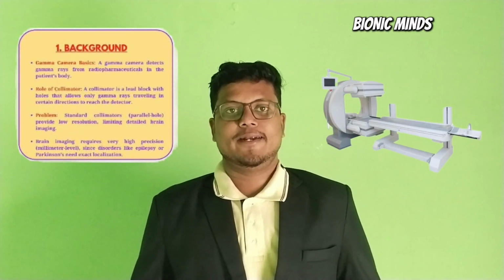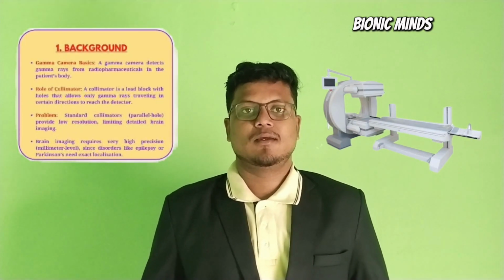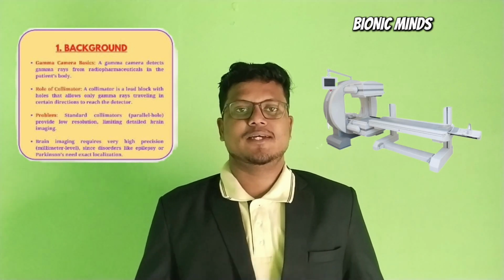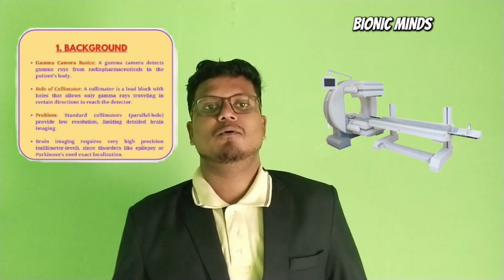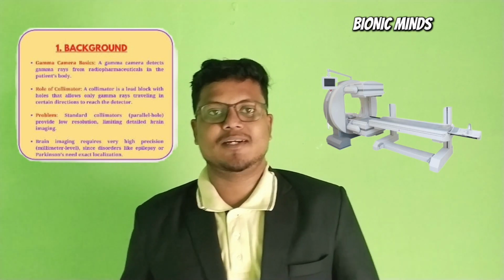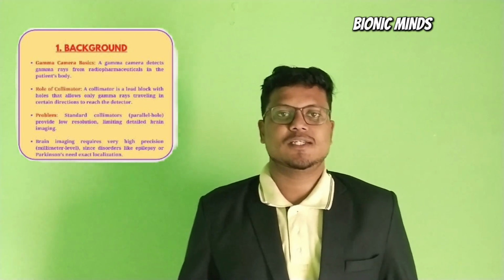The gamma camera is a vital component in nuclear imaging. It detects the radiation emitted by the radiopharmaceuticals inside the patient's body. However, the radiation travels in all directions, which can blur the resulting images. To obtain clear images, we use a component called a collimator. The collimator is made up of lead and contains holes. The lead blocks the rays and allows only specific directions to reach the detector.